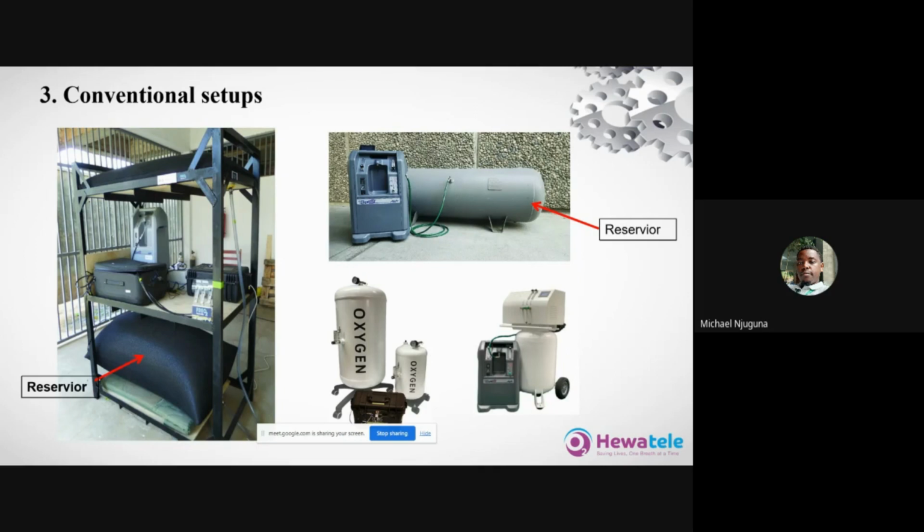So on this design, or rather this conventional setup, this is a prior design, and I don't have the rights to present it, because this is not a design that we have worked with, but it is a design that has a very unique reservoir. The reservoir here is not metallic. It is a bag that is filled with oxygen based on the filling station, and also there is a tank at the top part of this setup.